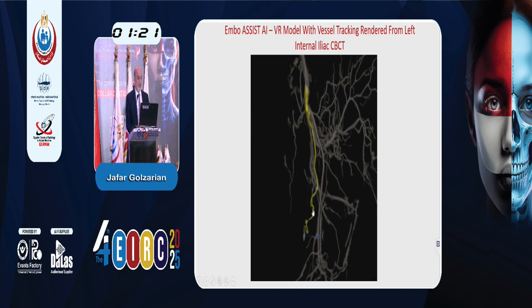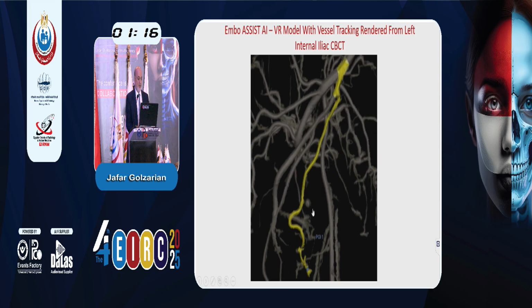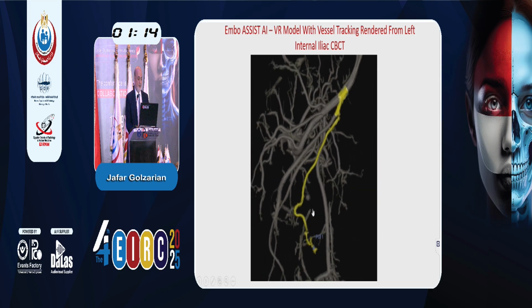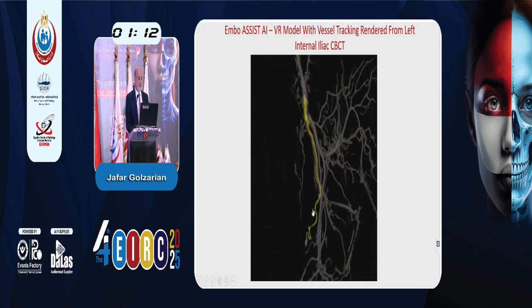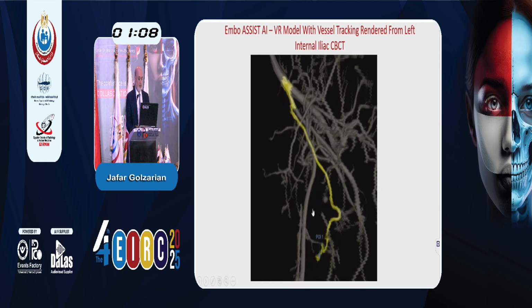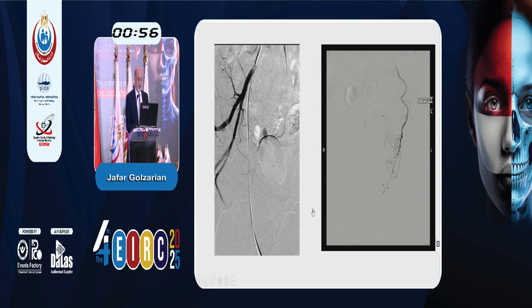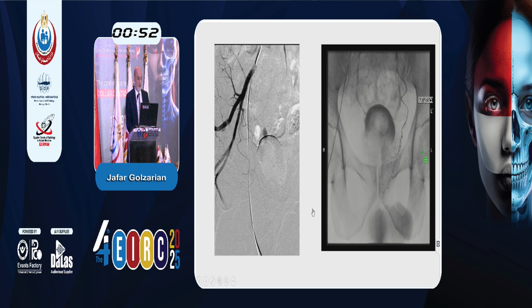And then we click on the prostate and click on the artery on top, and you can find the origin. You can see when you rotate around it that there is an acute angle in that artery, which makes catheterization a little more challenging. Then you can use that as your roadmap without any extra contrast injection, and get to the vessel and go selectively. So here is a case where I embolized the left side without any problem.